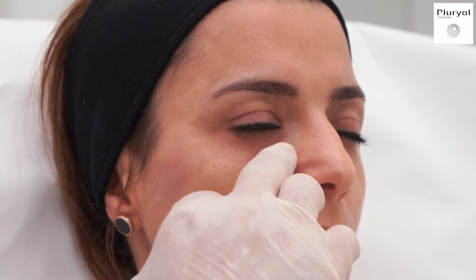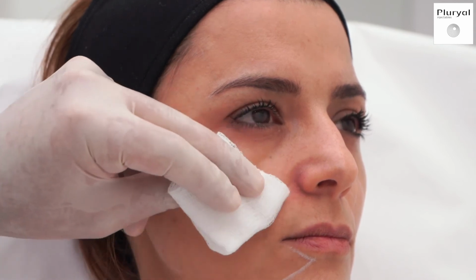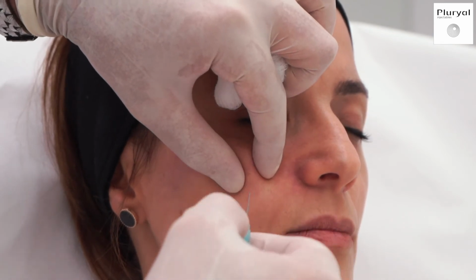Now I will be working on the infraorbital area. I always use the cannula for this area because it has a lot of vessels and it can bruise easily. I like to use Pluryal Classic lidocaine also for this area, so I will be treating the tear trough and the lateral infraorbital, like the junction between the cheek and the eyelid. I do the whole area.